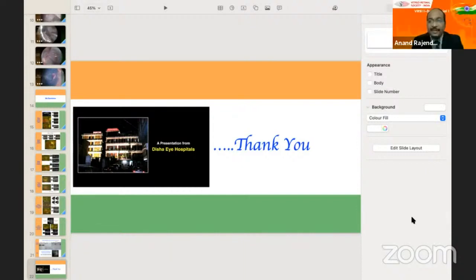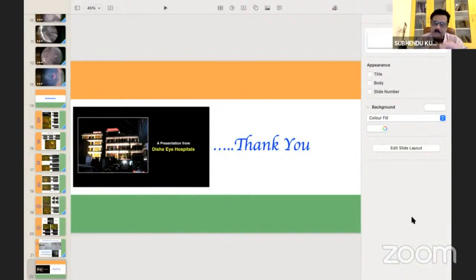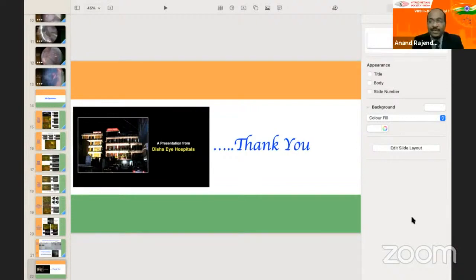It's leathery. The CNVM becomes very leathery, so that the cannula gets stuck with the cutter. It insinuates between the cutter and the cannula inside, and so it will be stuck. You cannot go inside, so you have to go out and inside and then go out, so that you can loosen your cutter from the cannula. Personally, very often I've had to actually use forceps and remove it completely. It's almost as bad as cutting and doing a lensectomy.